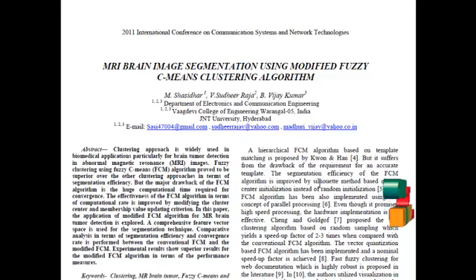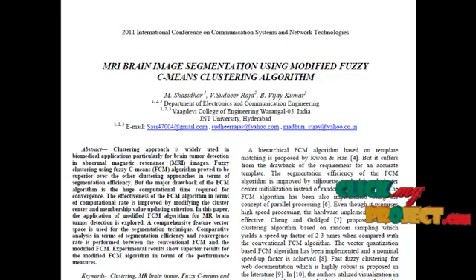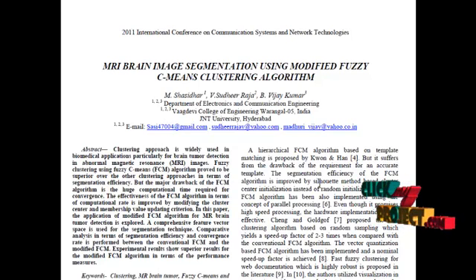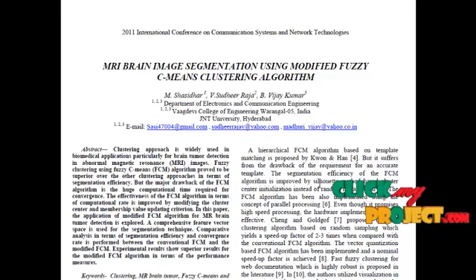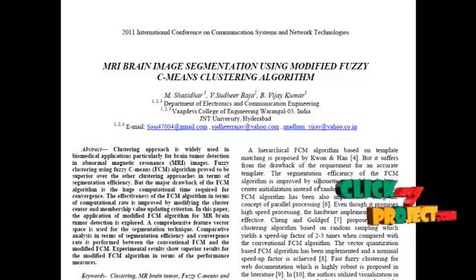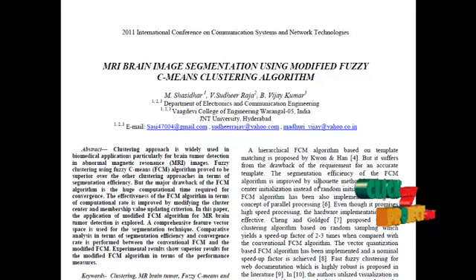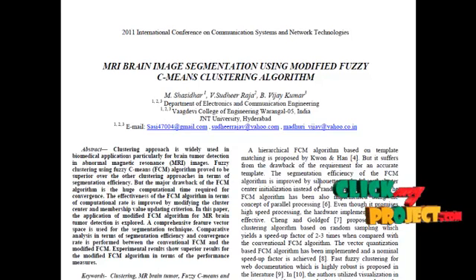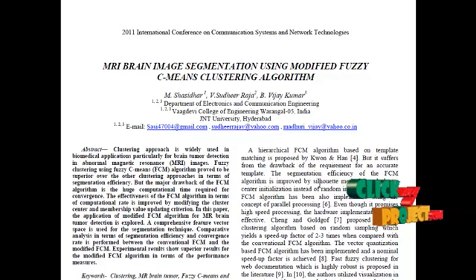Fuzzy partitioning is carried out through an iterative procedure that updates membership values and the cluster centroids. The update is repeated until the change of membership values is very small. We apply our Modified Fuzzy C-Means Clustering algorithm for the detection of various brain tumors.